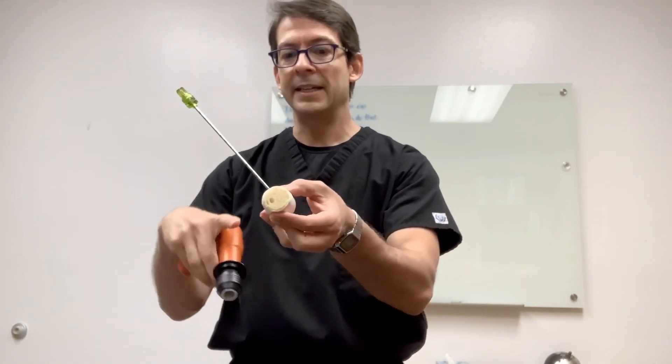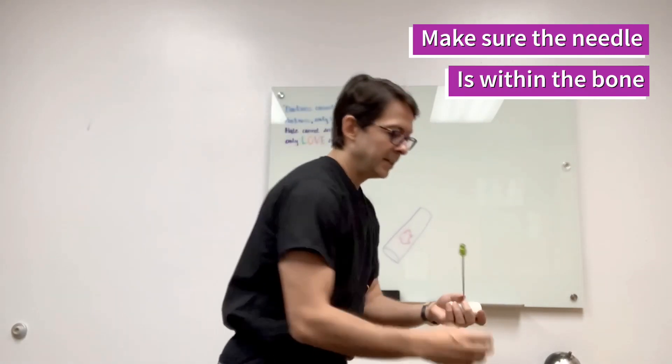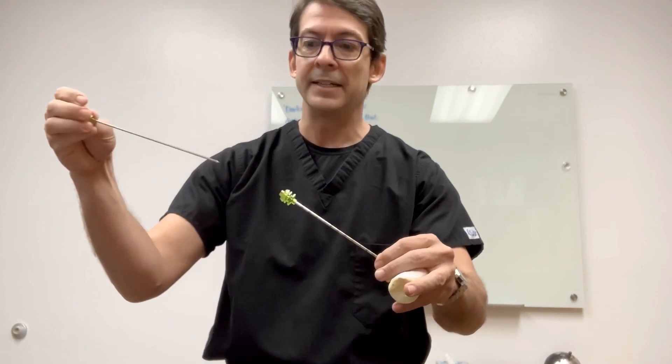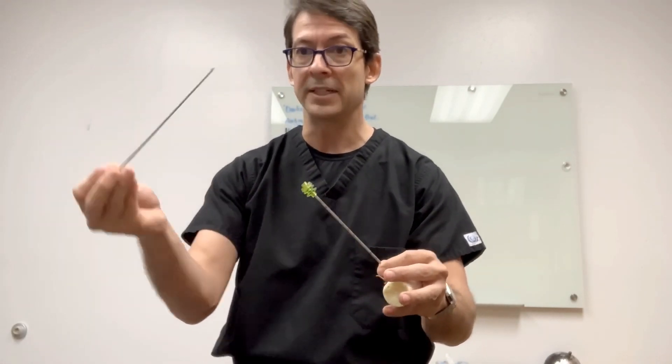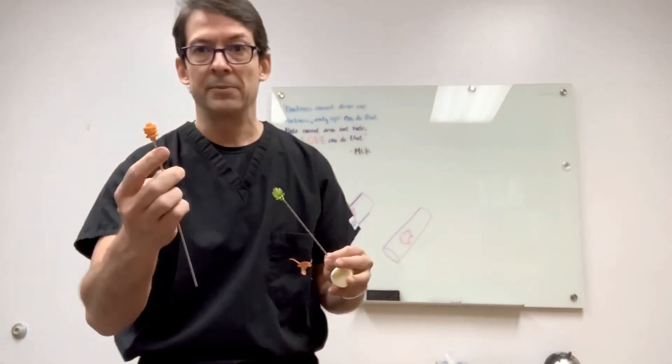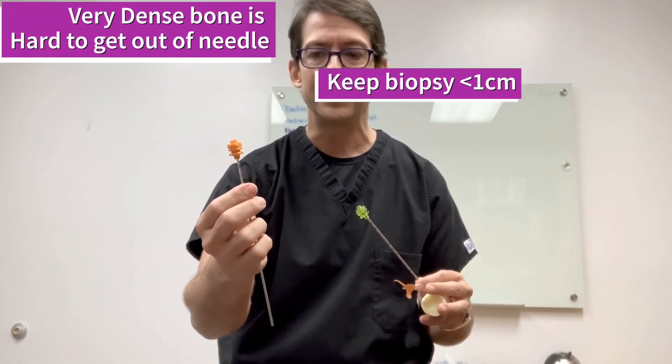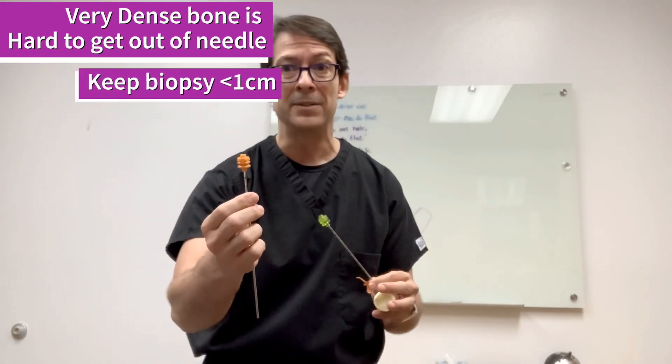Do a CT scan to make sure the diamond tip has passed the cortex. Once you've drilled all the way to the beginning of the lesion, take the inside needle out — the coaxial is already anchoring the cortex — and then take the biopsy needle to do the biopsy. It has three markings, and between each marking is one centimeter. If it's a very sclerotic lesion, I would not do more than one centimeter because it'll be very difficult to push out. If the bone is soft, I usually take a 1 to 1.5 centimeter biopsy; if very sclerotic, I do half a centimeter at a time.